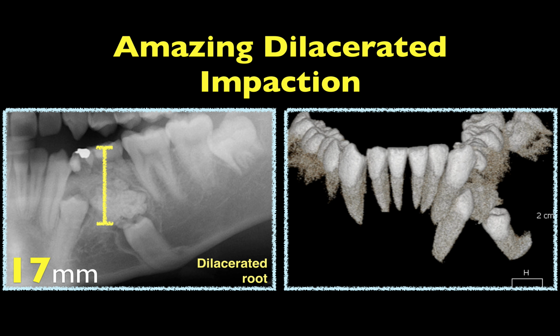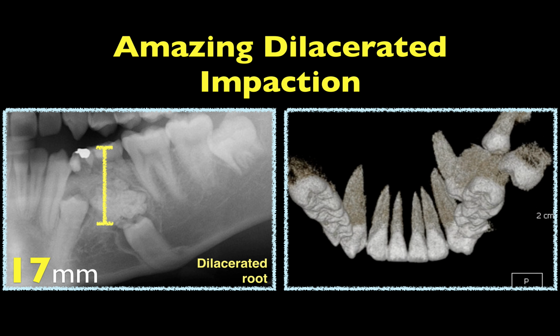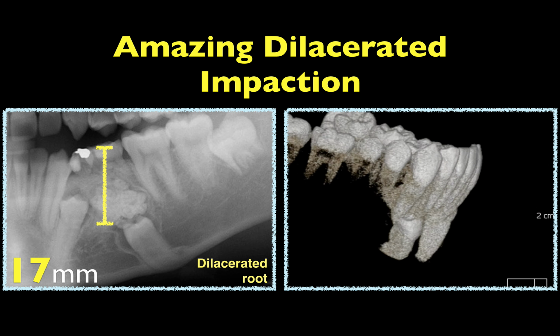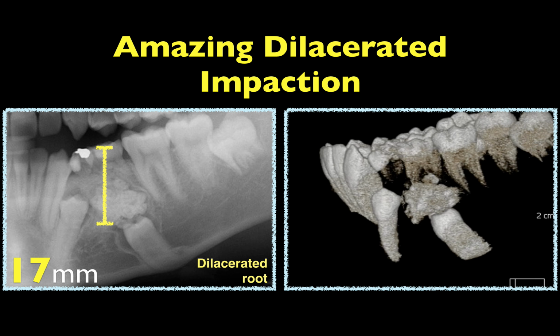Okay? So what is the third application? The third application will be impaction. The low impaction is very difficult to solve for 3 reasons. Number 1, anatomic, because of the nerve and the blood vessel. Number 2, because the density of the bone makes it hard to bring the impaction out.